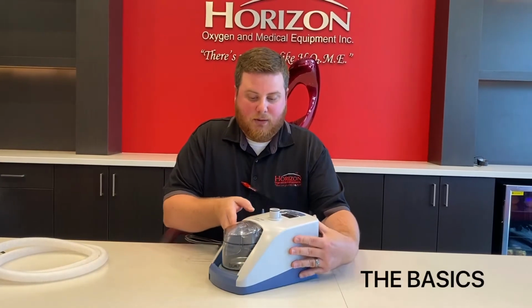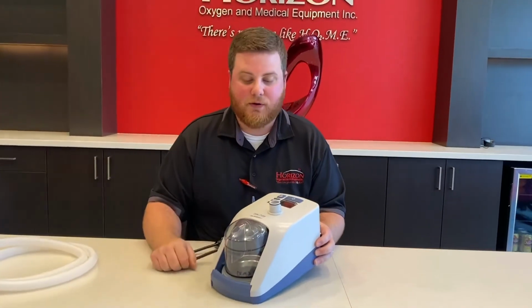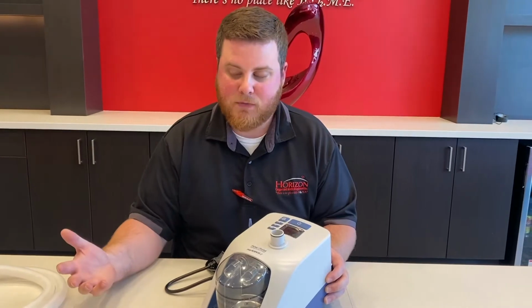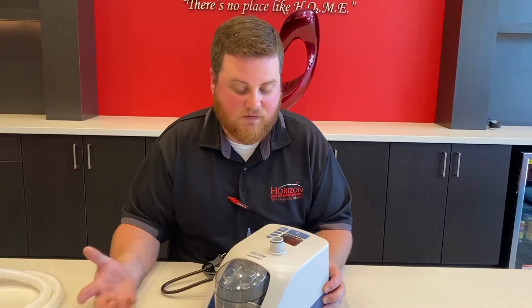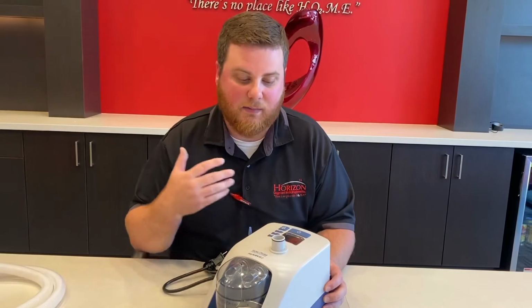Let me walk you around the machine first. On the very front of the machine, there's a humidifier chamber, just like how our CPAPs or BiPAPs do, or our concentrators have those humidifier chambers. Same thing that we're going to utilize here. It's a little different because it uses a vaporized humidification system, just to be able to tolerate those high amounts of flow.